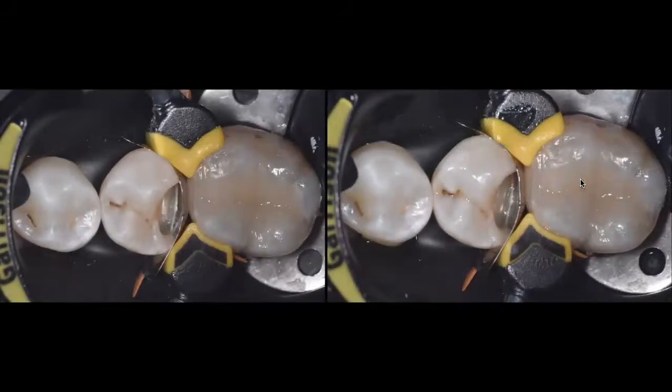Now, on that second tooth, you can see that I went ahead and removed the ring, removed the wedge, and removed the band on the premolar and on the molar. And then I placed the band again only on the premolar. And now you can see that the adaptation of the band and the way that the ring is pushing the band is much better than the first time that I applied it.